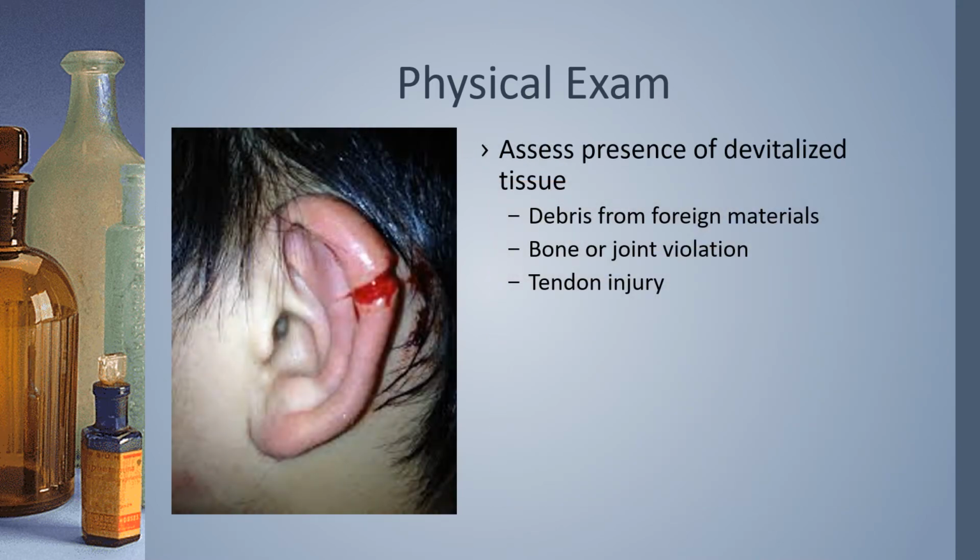So when you're doing that physical exam, you need to understand the indications. When are sutures appropriate? Sutures are appropriate when the depth of the wound will lead to excess scarring and the wound edges are not properly approximated. Typically, this is true whenever the laceration extends through the dermis. Some wounds amenable to closure with sutures may be better managed with an alternative technique, such as skin adhesive, which I absolutely love to use. People love it, it keeps the wound clean. It doesn't always work if that laceration is deep, though.